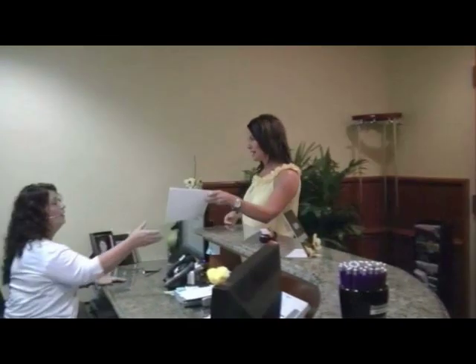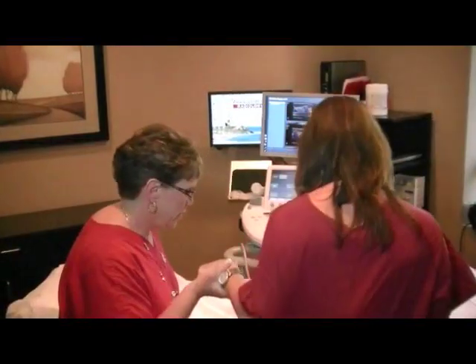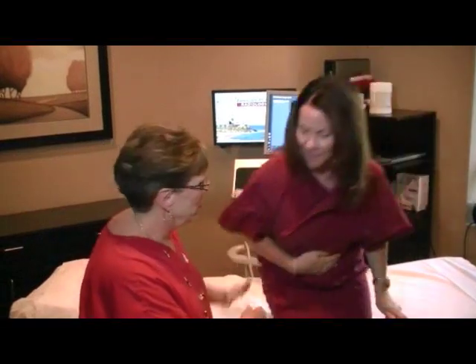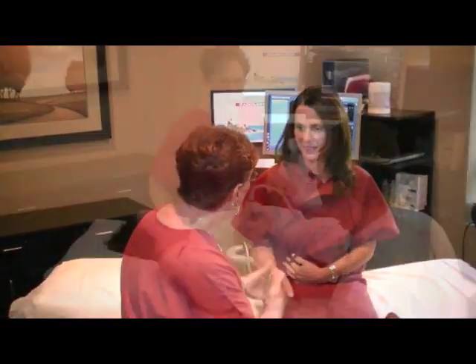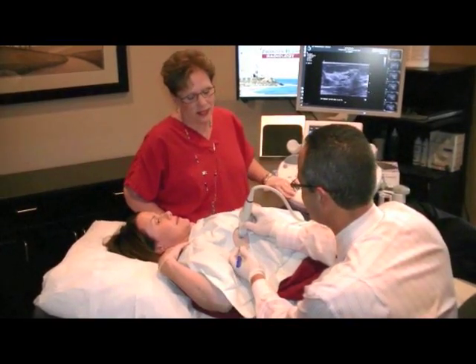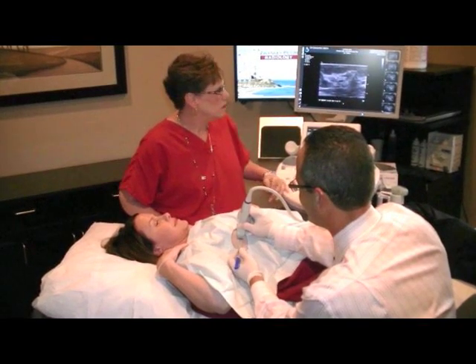After checking in with the receptionist, you will be brought to the ultrasound department. The sonographer assisting me during the procedure will perform a limited ultrasound examination targeting the region of concern and will take some pictures. Some marks with an ink pen may also be placed upon the breast skin surface. I will also be imaging the area before we get started.